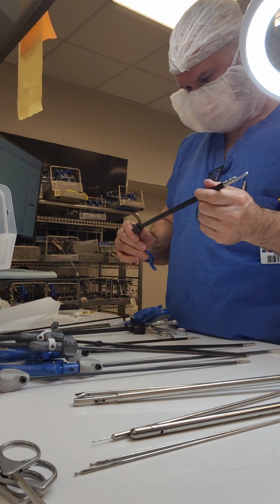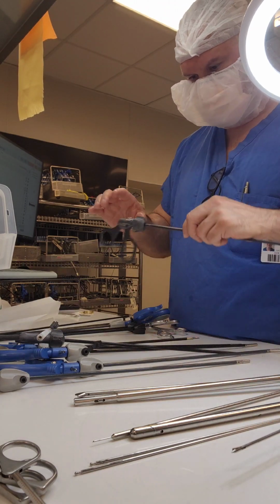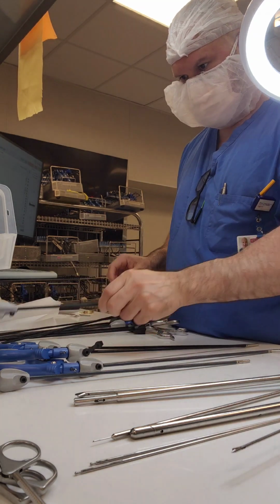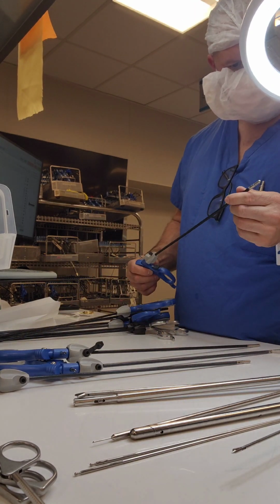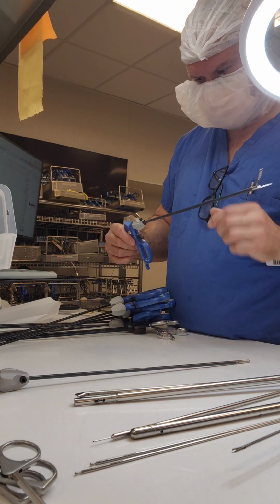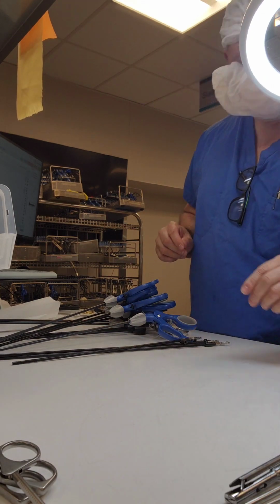It also gives you an opportunity to feel for any nicks or cuts on there. Like, see, I felt a little rust spot there on that instrument. I saw that it was damaged right there in the base. I saw that it was torn apart, so I pulled that off to the side. Checking the instrument, this instrument here, you have to check the tip because there's a little washer there. Make sure that it's intact and good. Continuing my inspection, it gives me a chance to feel that insulation for any cuts in the insulation or any nicks that are going to expose the metal down there. For those that are nicked up like that, I don't even have to use the insulation tester because I see the damage, right? So continuing to feel.